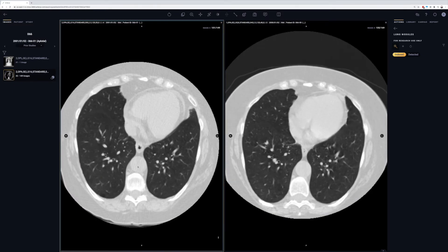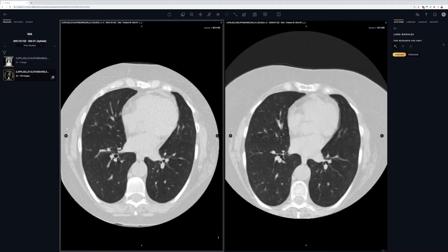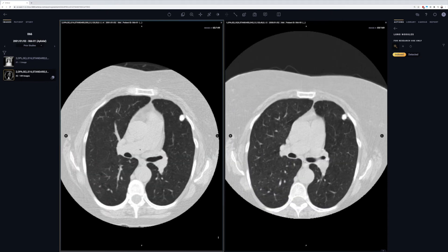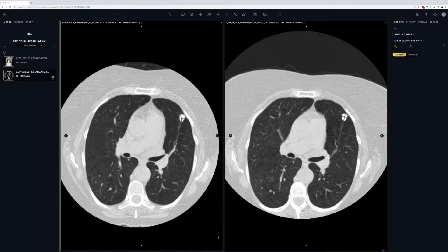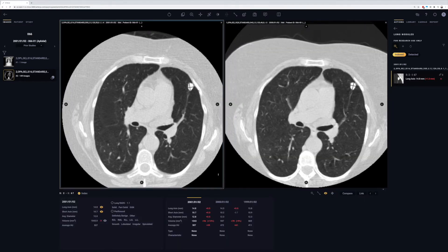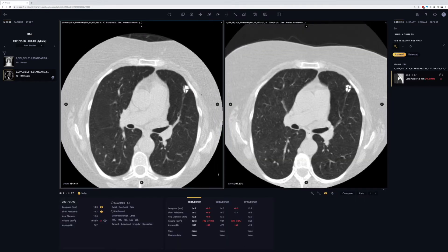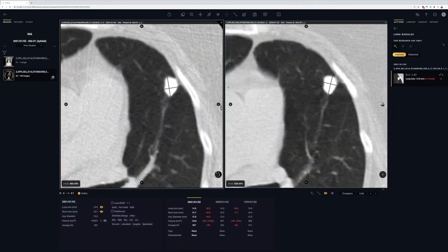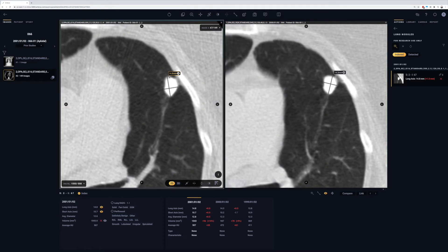You can start by scrolling through axials, looking for lesions you wish to index, and simply click on them, which triggers Arteris to automatically index and measure the lesion in both 2D and 3D space. All lesions are automatically added to your report.